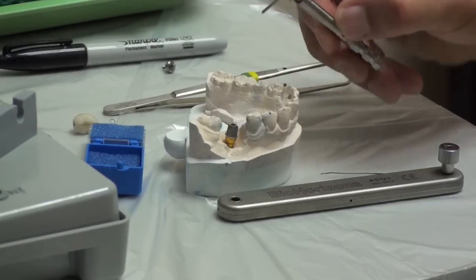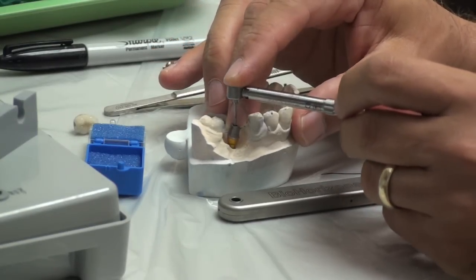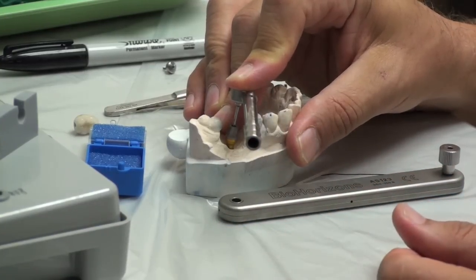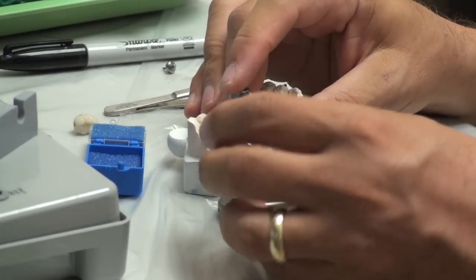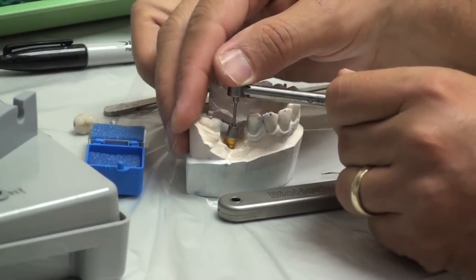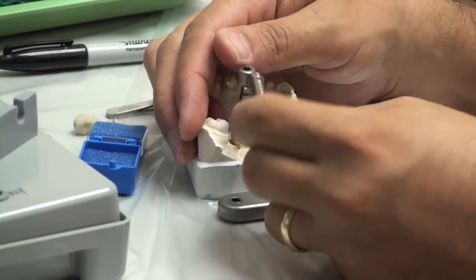The steps preceding that: it needs to be torqued two more times. You've torqued it once, it needs to be torqued a second time - put it back in, make sure the hex is totally engaged, hold it down firmly, push until it breaks, and no more. Do not keep pushing it - you will break something. This only works until the moment that break occurs. Take it out, snap it, do it again. It may seem unnecessary, but the screw stretches as you do this, and between times it stretches it relaxes.